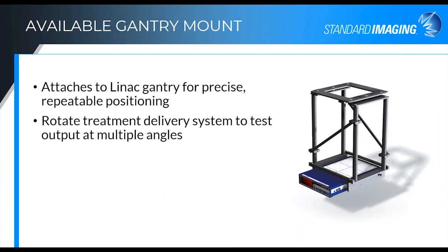There is an available gantry mount that allows you to place the device, this mount in the collimator head, and precisely aligns this surface to be at isocenter and aligns it to the light field, and allows you also then, if you wish, to treat at multiple angles and test that. Some physicists like this for the repeatable positioning, and others feel it's a good part of that test to do it without a gantry mount.